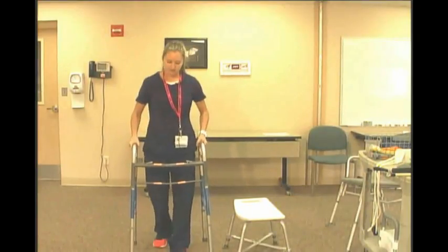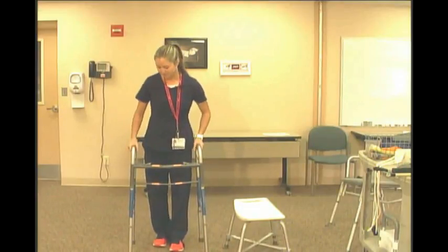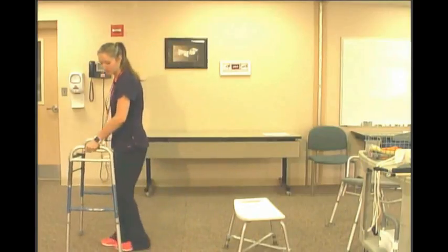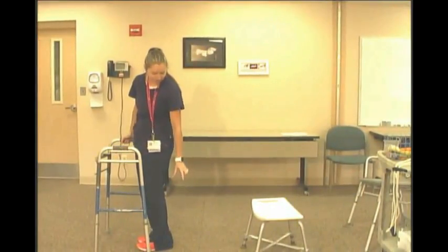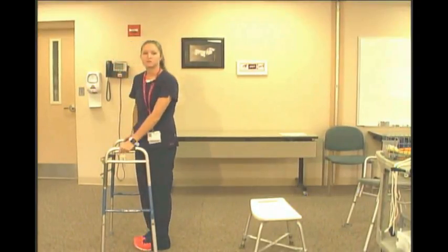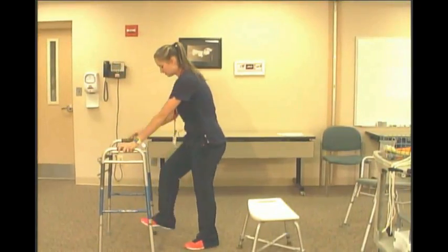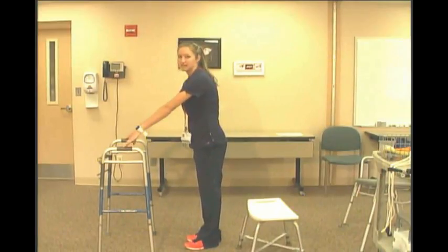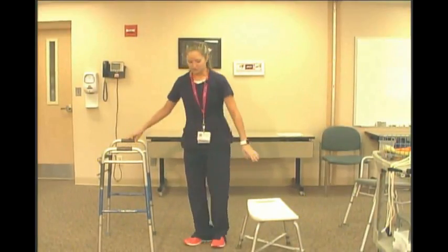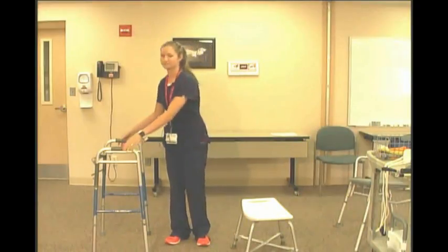Now let's say you have a smaller shower at home and you're unable to get the walker in, which happens often. So in that case, we would have you back up. If you imagine the lip of the shower is behind me, my heels are up against it, my walker's right in front here. This time you do the opposite. You do the good leg first. Good leg goes back and in, sore leg goes up and over. Walker is staying outside the shower because it doesn't fit. Then you would turn and you'd have the seat behind you and you'd sit. That's how we would recommend doing the shower transfers. We will, of course, practice this with you after your joint replacement when you're here in the hospital.